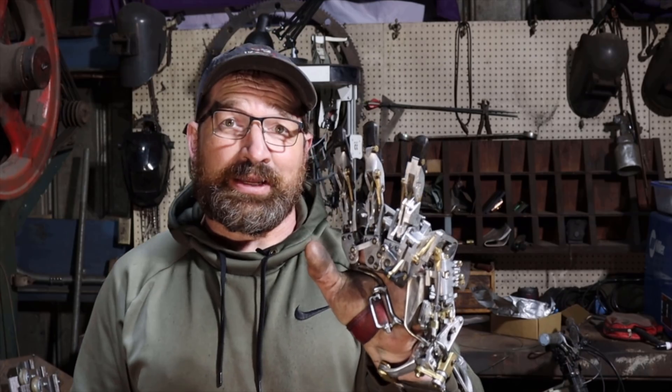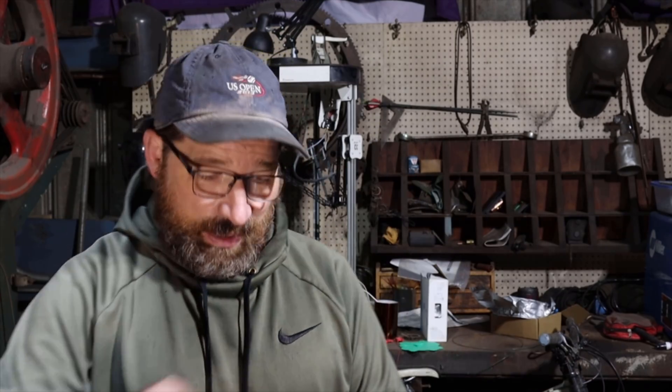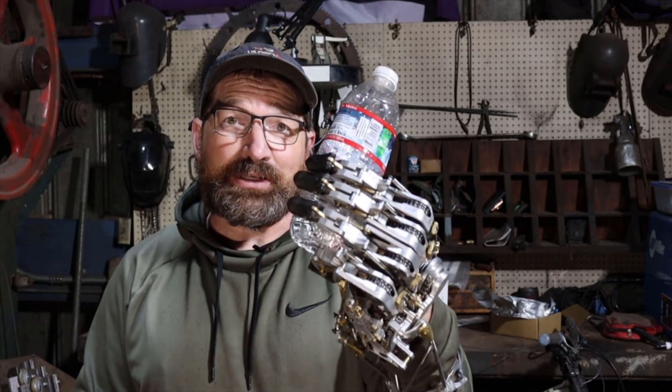Fifth grip pattern is pinkies locked, index, middle, ring move. I use that for holding onto glasses or cups.